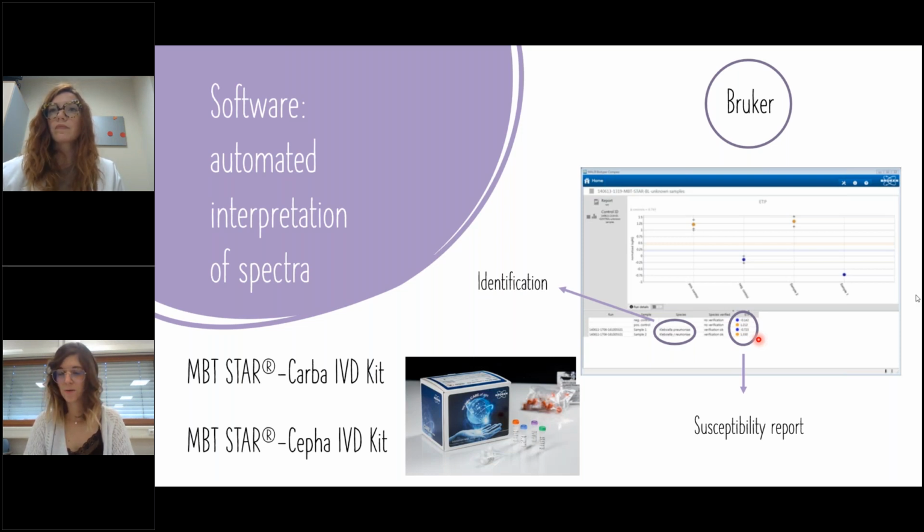In the meantime, we just received other questions. We have one from Stefan. Do you use MALDI-TOF for other applications than bacterial identification, or OXA-48 meropenem hydrolysis in routine practice? Yes, I use imipenem hydrolysis.